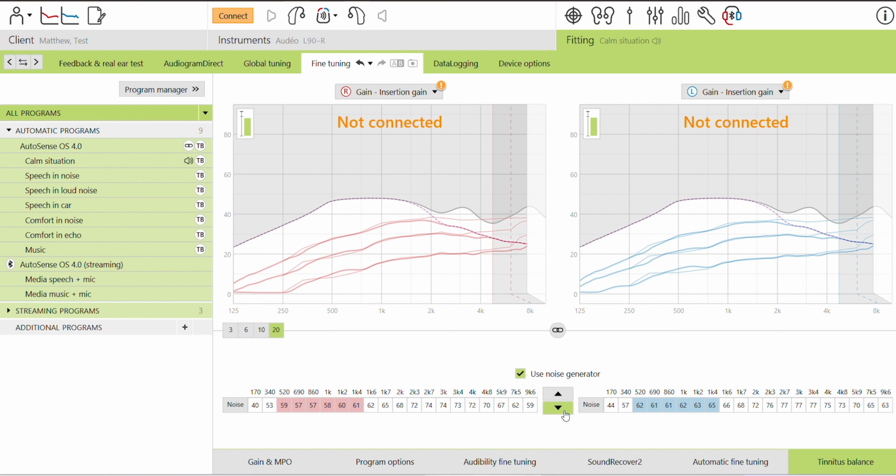Hearing aids alone can be a huge help in terms of treating your tinnitus, and employing tinnitus retraining therapy can increase the chances of helping you to overcome your tinnitus even further. The best thing for you to do is to work closely with your audiologist to identify which masking sound is the most effective for you.